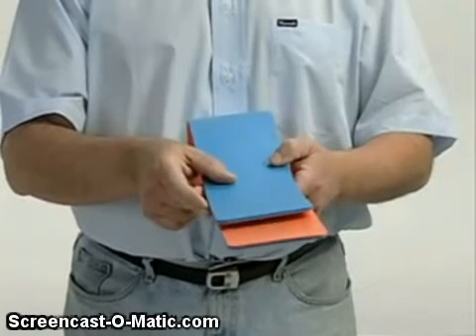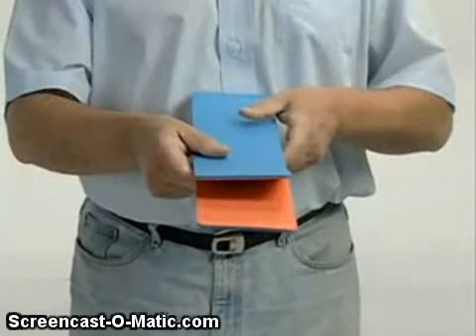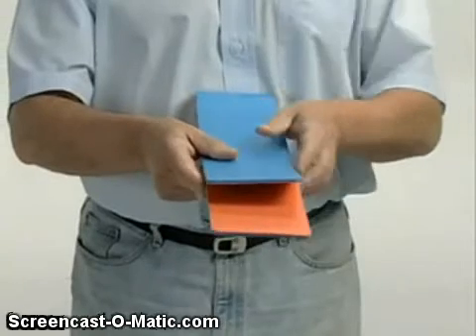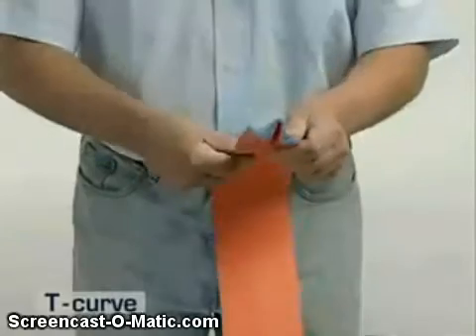Fold a 36-inch SAM splint in half so one half is approximately 4 inches longer than the other. Apply the T-Curve to the shorter half of the splint to create a T-shaped beam.